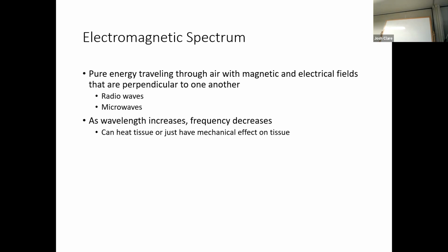The frequency is how many wavelengths occur per second. And these are settings I can mess with on the machine. I can have a really short wavelength. I can have really tall wavelengths. I can increase the frequency, which means there's more cycles per second than here. Right? 3 cycles in this example, 2 in this example, covering roughly the same. I'm not making these extremely accurately.